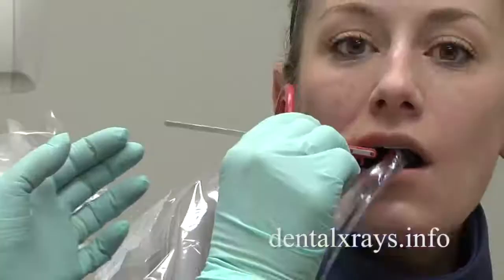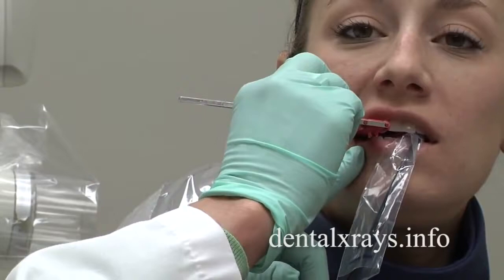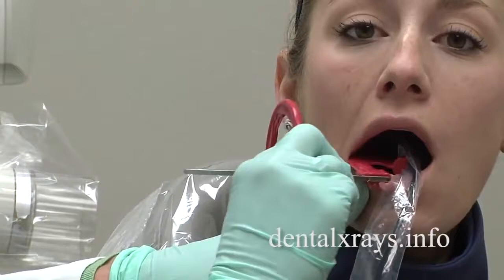However, when we're doing the premolar view, if I just move it toward the middle of the mouth and she bites down, I don't see the distal of the canine. So what we have to do is put it toward the middle of the mouth, and then what I call a cross arch — I'm twisting it in the mouth and having her bite down.